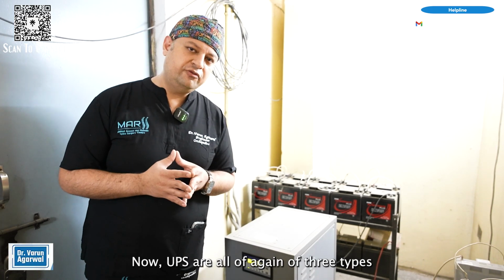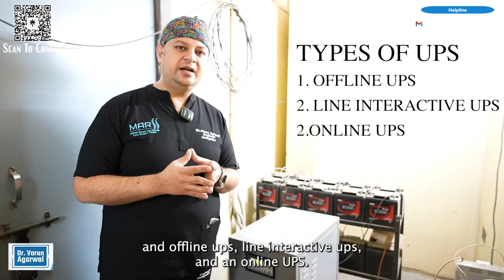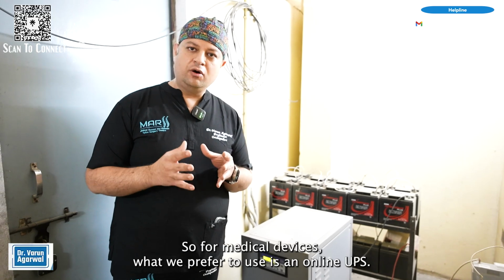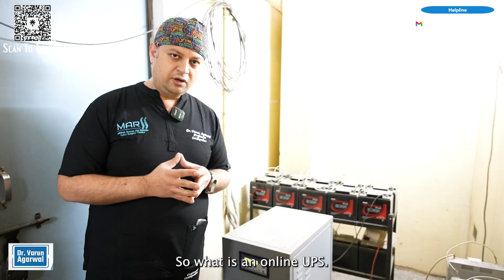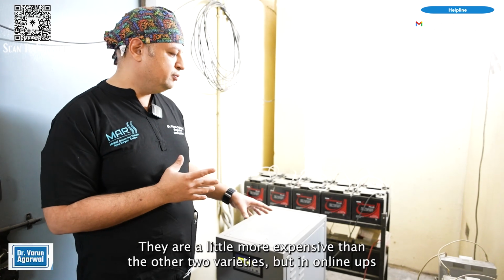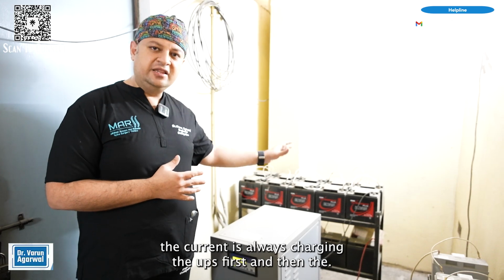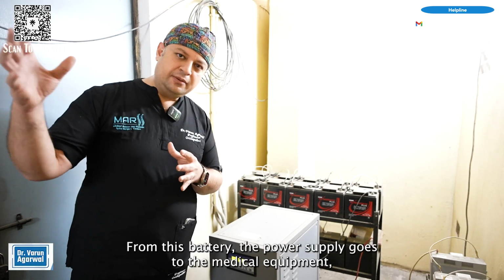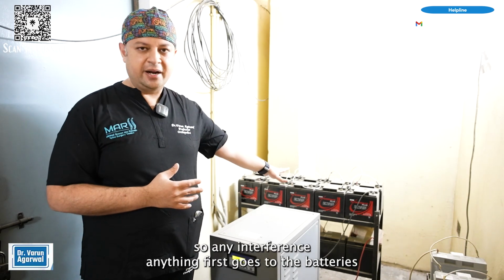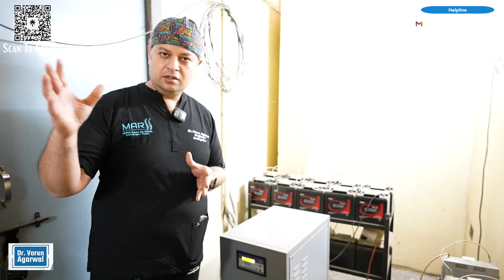Now UPS are all of three types: an offline UPS, a line interactive UPS, and an online UPS. So for medical devices, what we prefer to use is an online UPS. So what is an online UPS? They are a little more expensive than the other two varieties, but in an online UPS, the current is always charging the UPS first, and then from this battery, the power supply goes to the medical equipment. So any interference first goes to the batteries, where it gets absorbed, and then it powers the medical equipment.